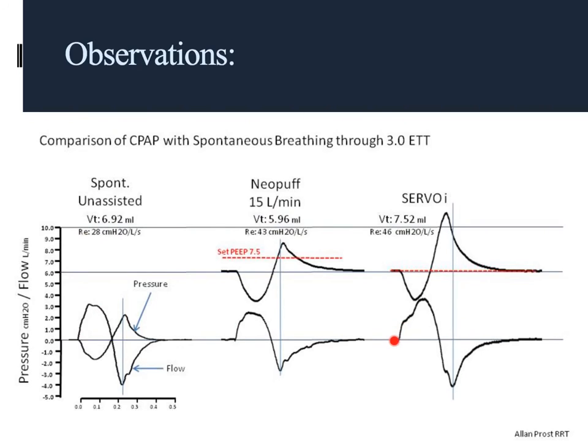And you'll notice our inspiratory flow rates, initially, they start off with the patient breathing, and then we get this little bump here. And I suspect that's because the servo-I is augmenting, even though it's in the CPAP mode, is kicking in with a little bit of pressure support. And that's why you'll see our tidal volumes being a little bit larger here than with even the spontaneous unassisted model, even though we've induced some work of breathing.